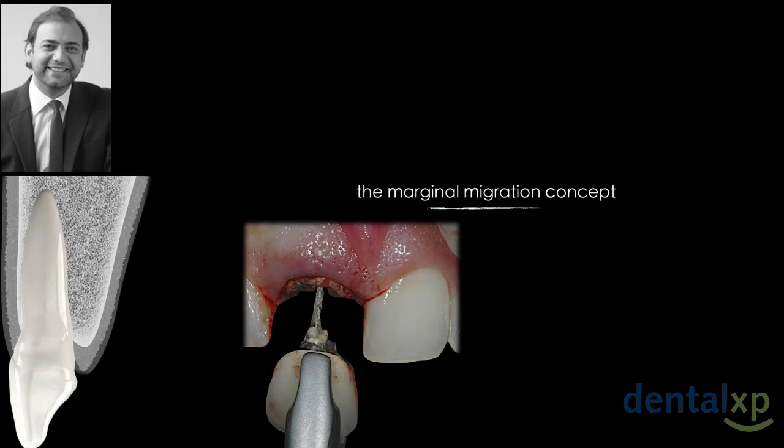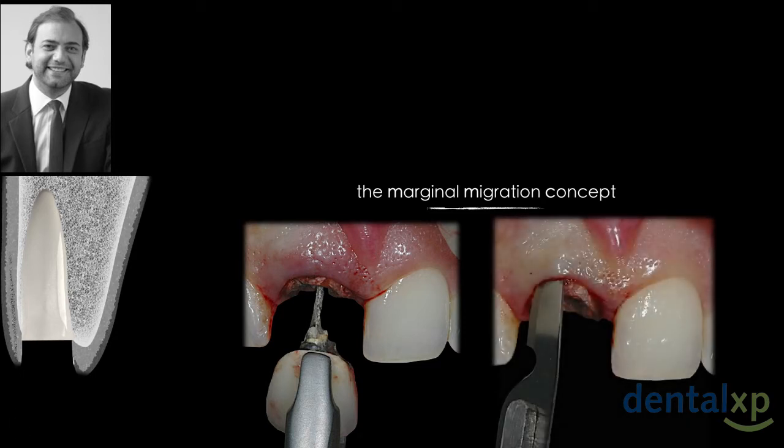We remove the restoration, and before removing the root, we use the 15C blade, as you will see here, to go up to the mucogingival junction and create a tunnel, as we would do in order to place a connective tissue graft. The reason we do that before extracting the root is because it helps us guide our blade or our tunneling instruments, as we see here.